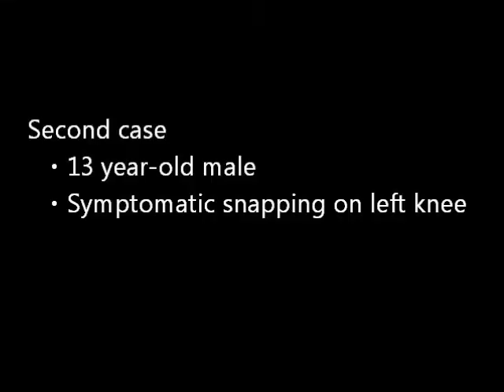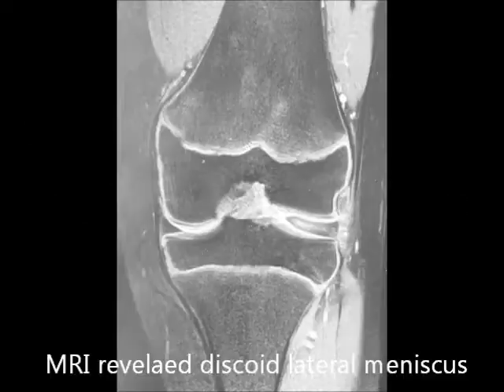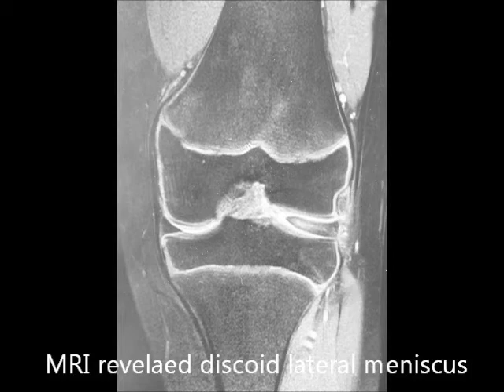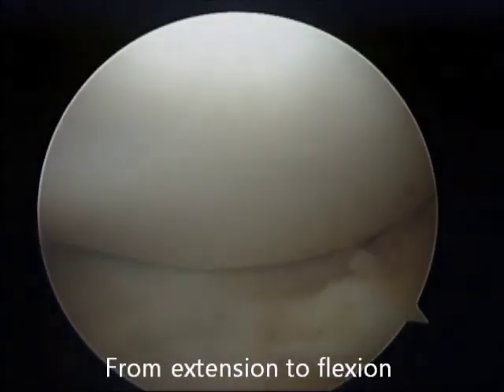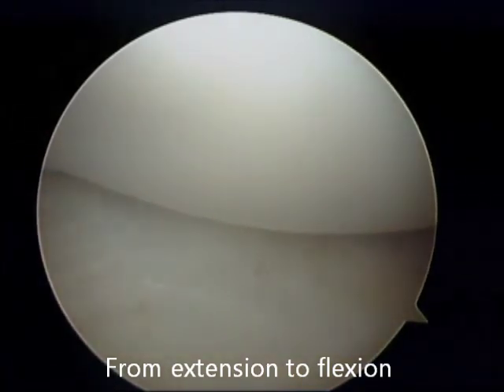The second case is a 13-year-old male whose chief complaint is symptomatic snapping with motion on his left knee. MRI also reveals discoid lateral meniscus with horizontal tear. In the same way, we can confirm the abnormal movement of the discoid lateral meniscus.